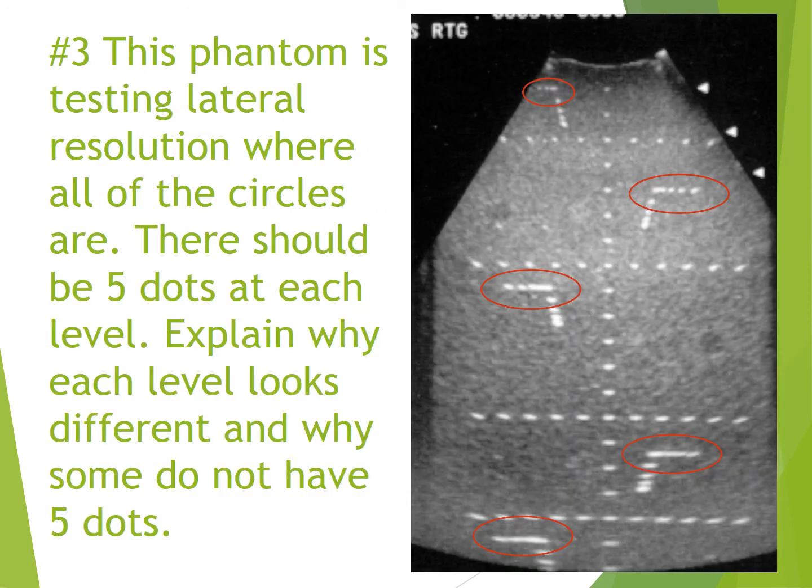Number 3, this phantom is testing lateral resolution where all of the circles are. There should be 5 dots at each level. Explain why each level looks different and why some do not have 5 dots.